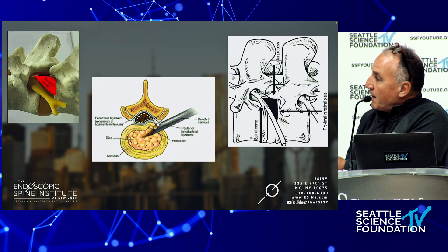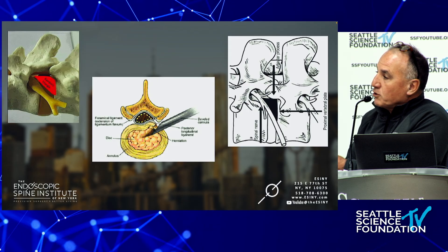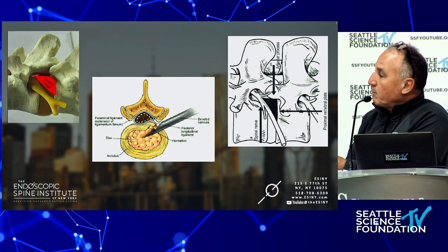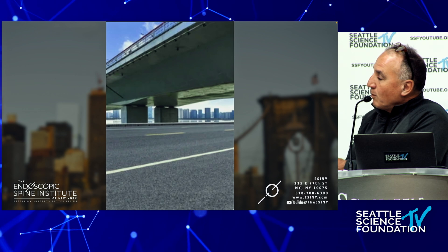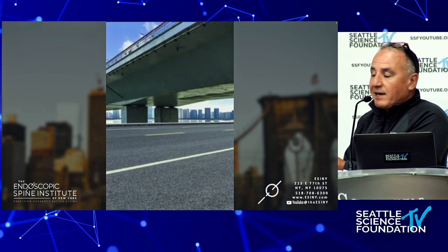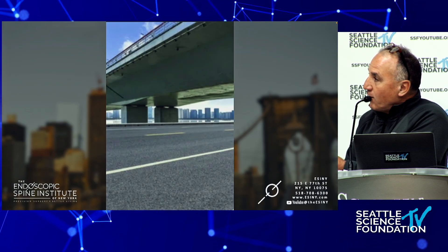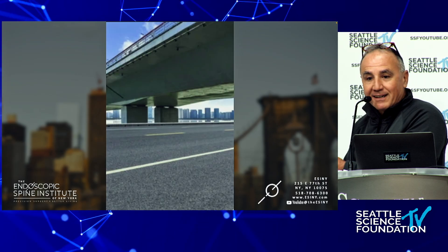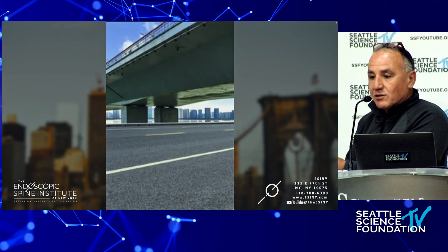This is what the SAP looks like — an imagined version — but there's usually a SAP in here that acts as a barrier. What I like in transforaminal surgery is taking a small plane and trying to land it underneath the bridge without falling into the water. The water is the spinal fluid; the bridge is the SAP. That's the trick we need to accomplish.